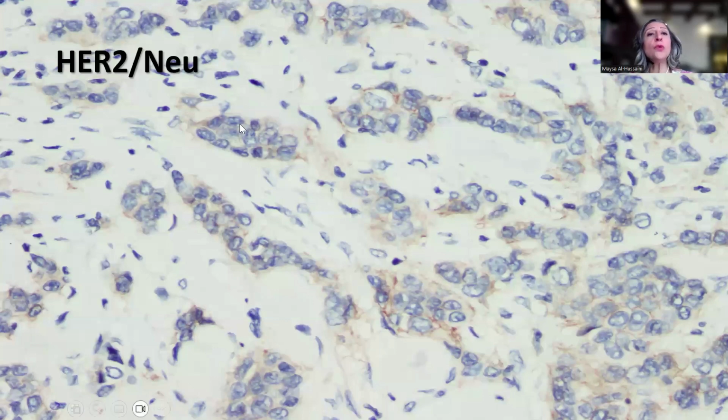Now, HER2/neu is also almost considered a negative or 1+ interpretation. Remember nowadays that we assign these 1+ HER2/neu positive invasive ductal carcinoma cases into low, we call them low expressors, because of the availability of conjugated treatment for the low expressors of HER2/neu, especially the 1+ cases.